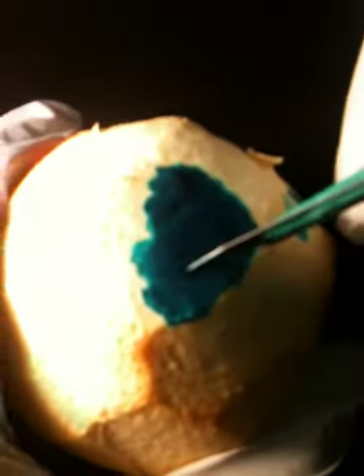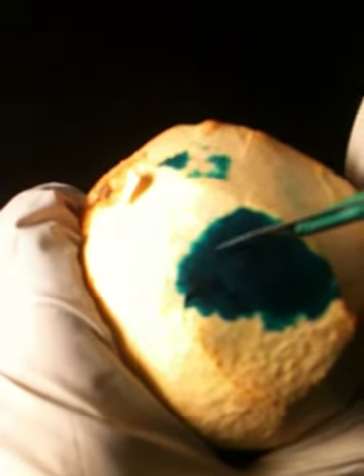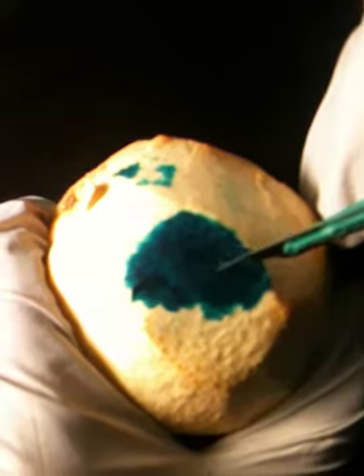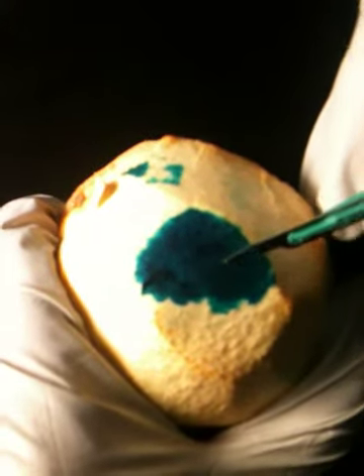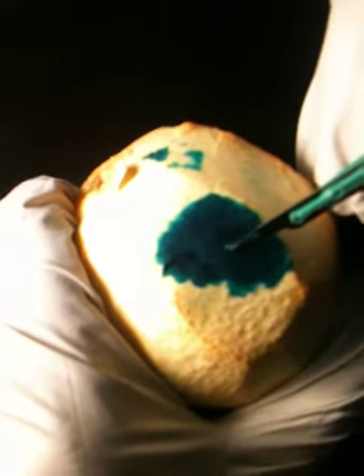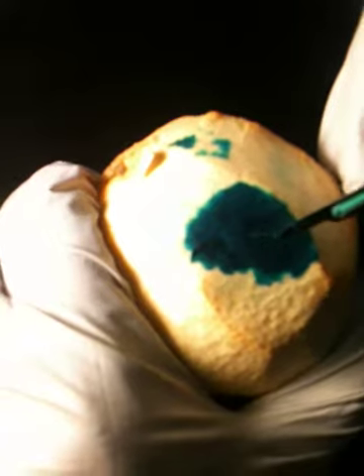Make sure that you do some parallel lines and then just go perpendicular to it, so that you're not going deep, because if you go deep... and now you can see, I think I went deep here, and if you go a little deep, you can see the tissue becoming a little lighter.